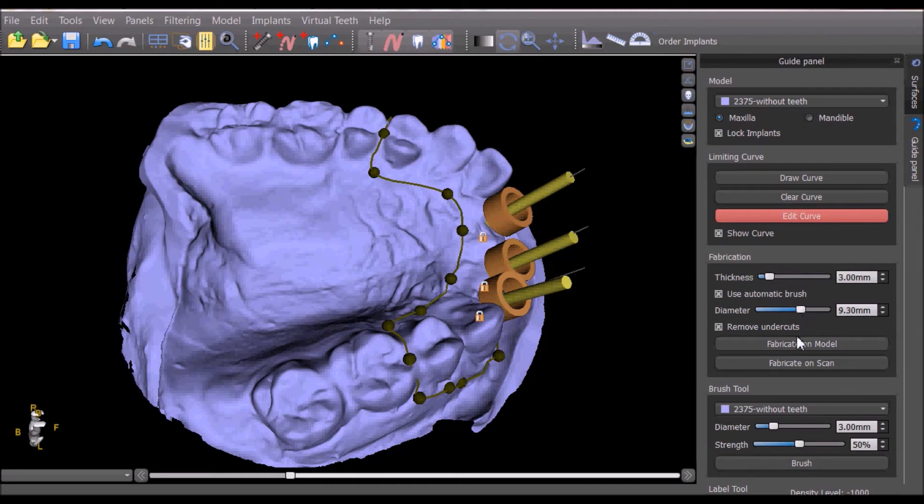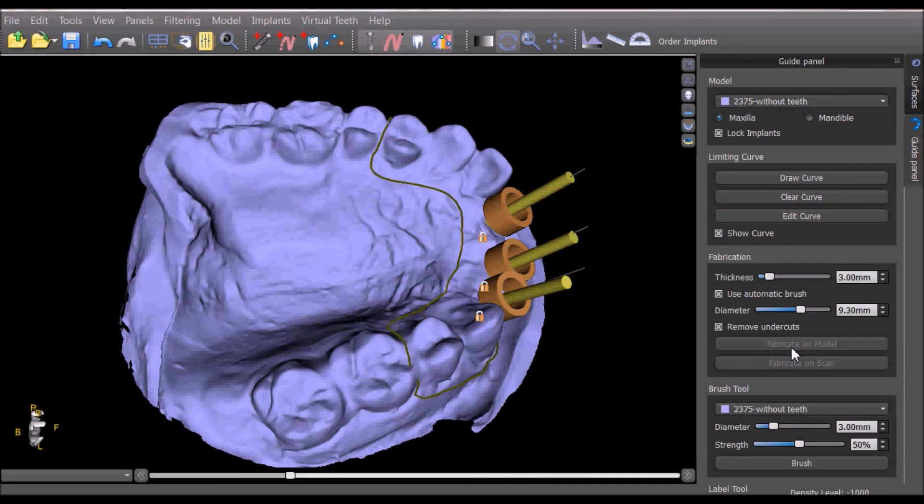We can then press the Fabricate on model button for the software to fabricate the surgical template.